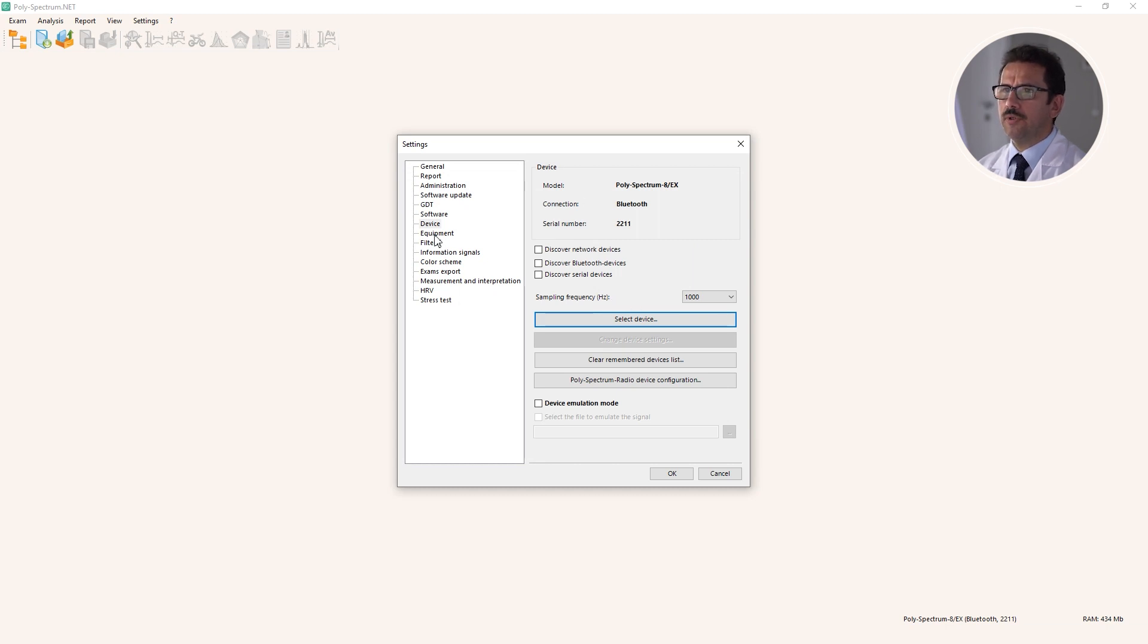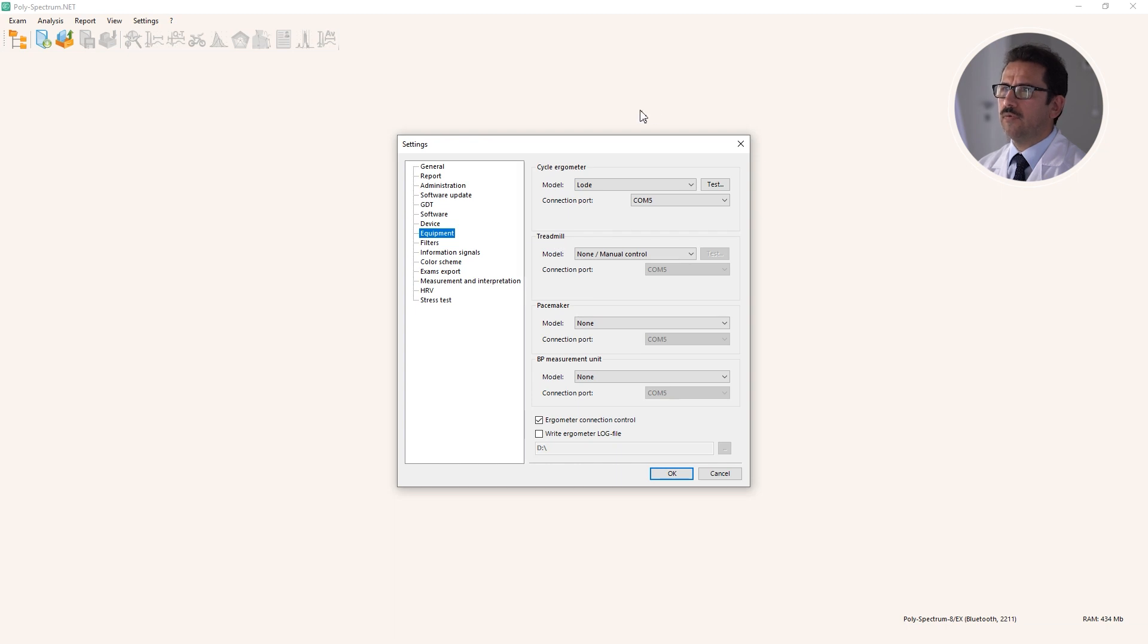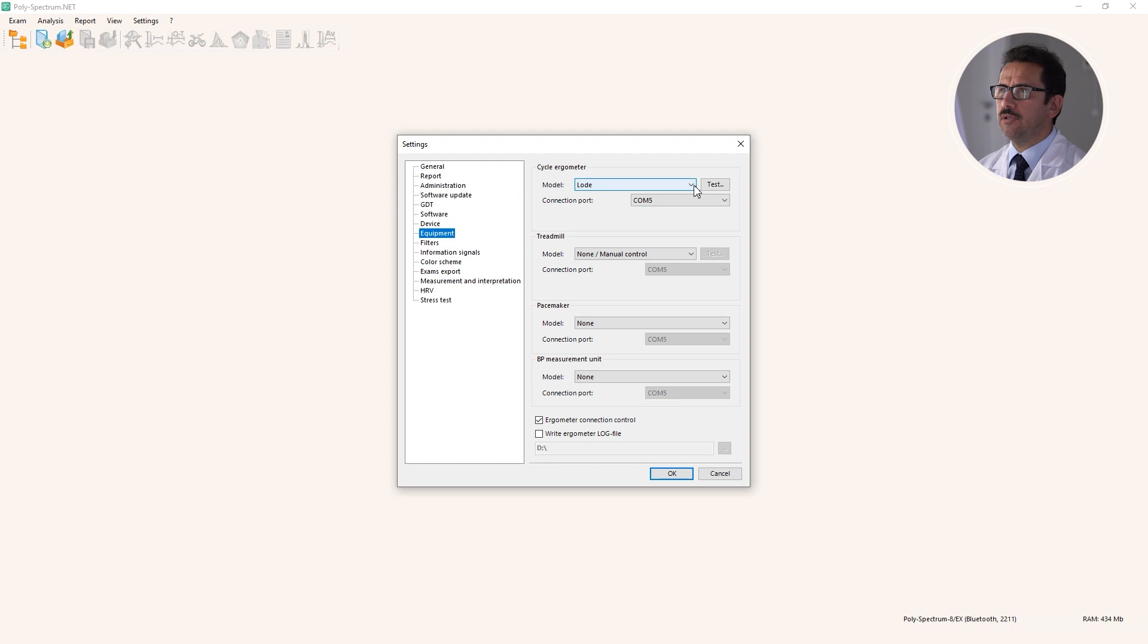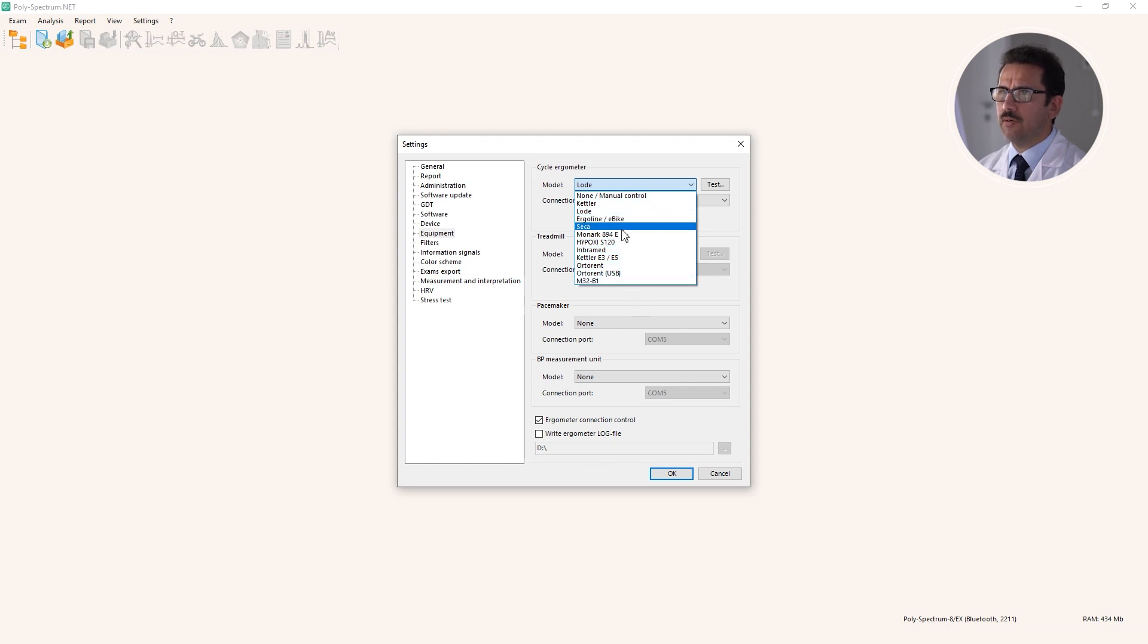Another point is the equipment. Here we can select cycle ergometer or treadmill. For example, here we have the Lode model, and if we open this drop-down list, we see that a lot of different exercise stress testing devices are supported by our software.